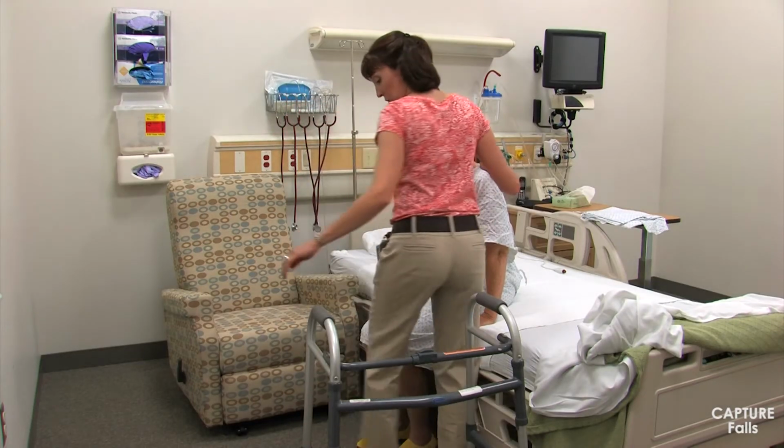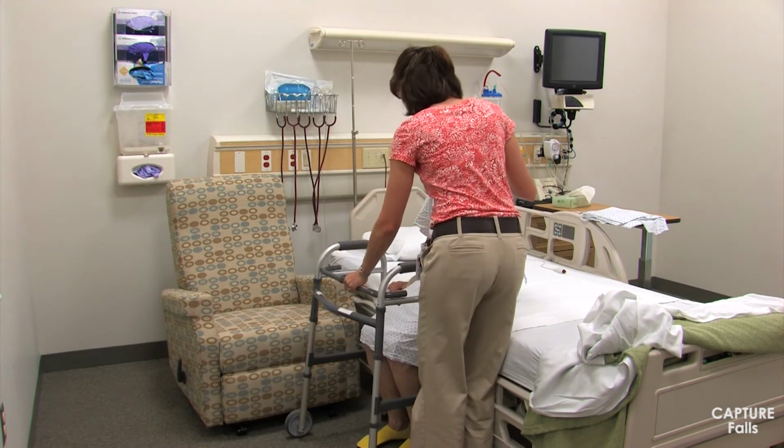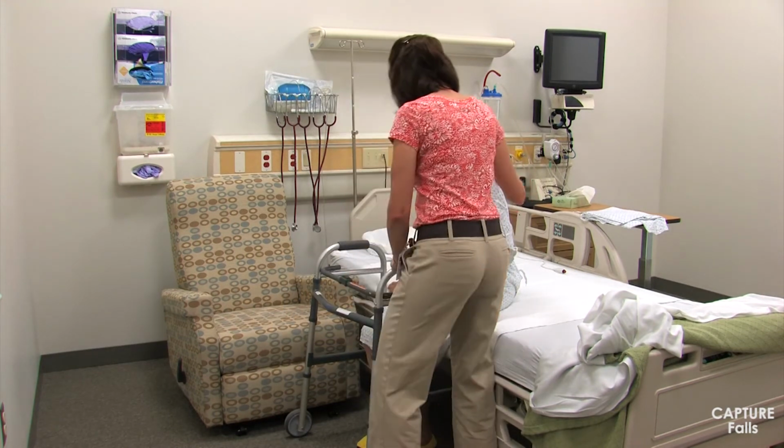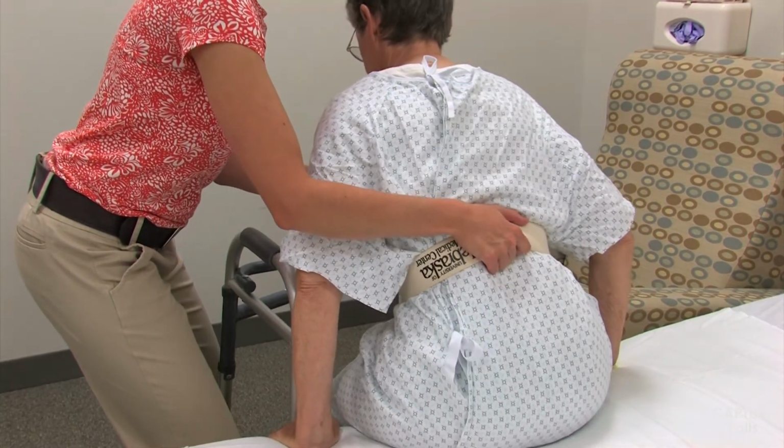Notice that I have the assistive device within reach. I have already gotten it close by before having the patient sit up, so that I don't have to leave her unattended on the bed while going to get the walker. Next, to help the patient stand, have her place both hands on the edge of the bed. She can reach for the hand grips of the walker as she assumes the standing position.